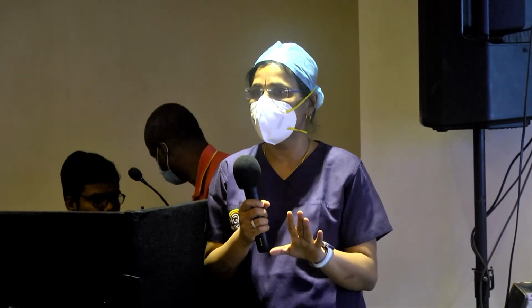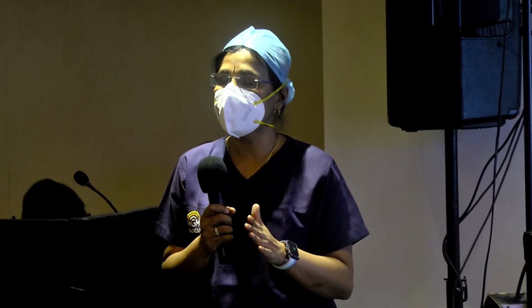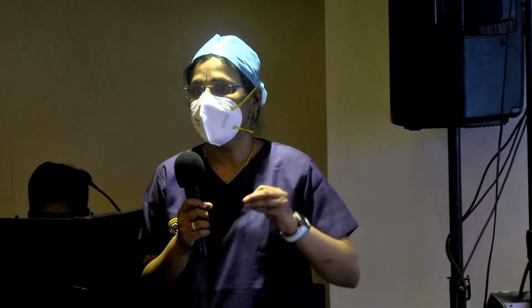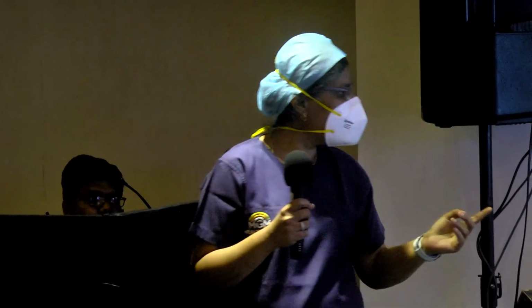Finally, if nothing is going to happen, we are not going to achieve all this, and the patient is having fulminant pulmonary edema that we are not able to manage, the immediate bedside option is putting an LV vent. So an LV vent can be instituted at the bedside. What we usually do is surgically perform a thoracotomy, put a cannula in the LV, the left ventricular apex, and connect it to the drainage site. I hope the LV vent video is there. It's not playing. It's okay, I'll show you sometime.